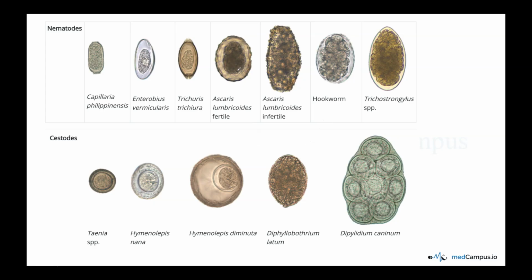So I hope you are following this session, though it is lengthy, but this is very important. Now you have the characteristic findings. Before entering into the trematodes, let's do a small exercise so that you will not forget whatever has been taught so far. Let's start with the colorless plano-convex egg, that is Enterobius. Colorless plano-convex egg.